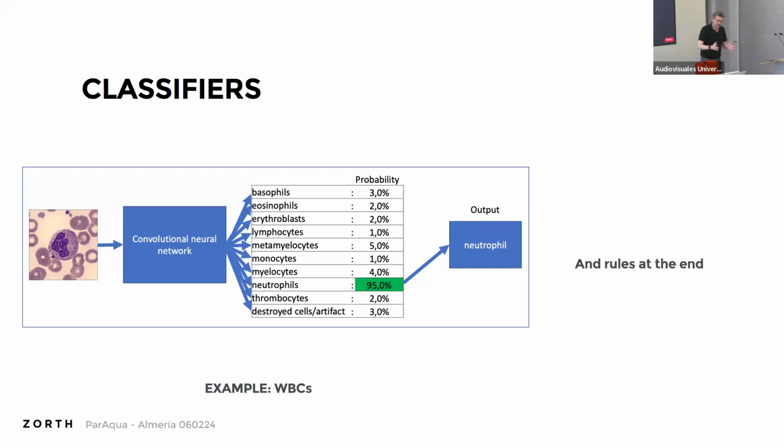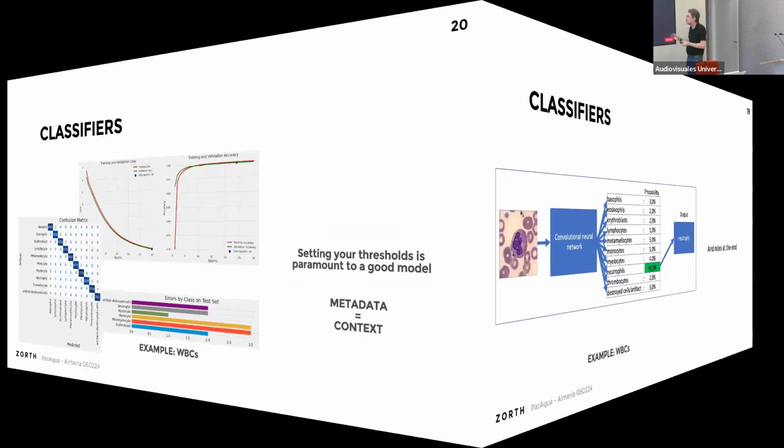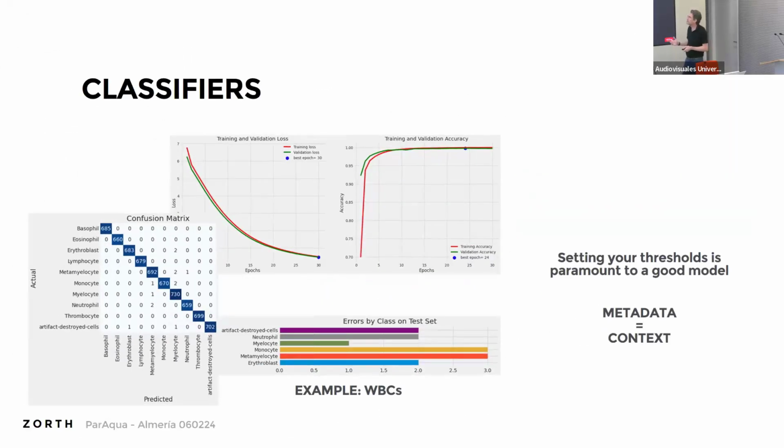I find that eosinophil, 64% confidence level. Yeah, they're good enough to me. I'm making an error of 1, 2, 3 out of 1,000. This is good enough. It won't get better. So those confidence levels, those trust levels, those thresholds, that's basically how you influence the thing.